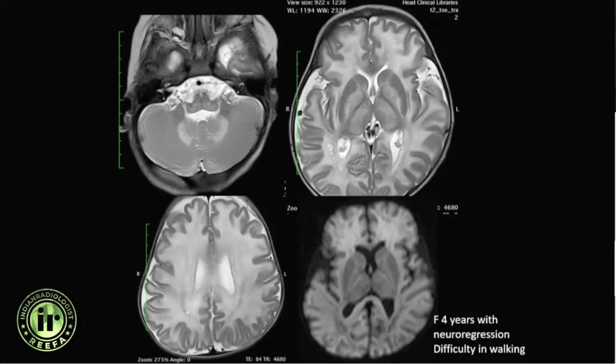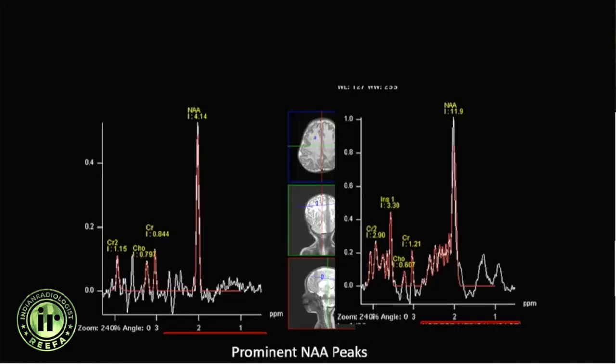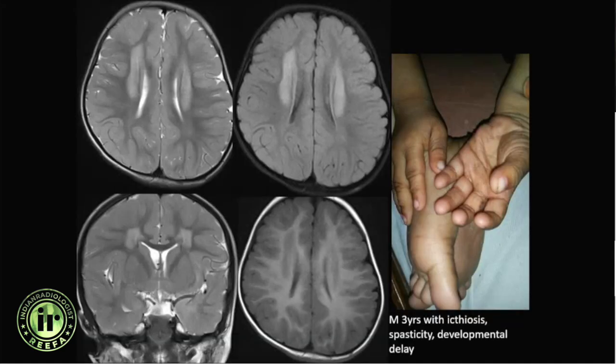A four-year-old with neuroregression showed diffuse white matter signal changes including the basal ganglia, globus pallidus, and thalamus, with a very prominent NAA peak on spectroscopy. Canavan's disease is one of the disorders in which spectroscopy helps in clinching the diagnosis.